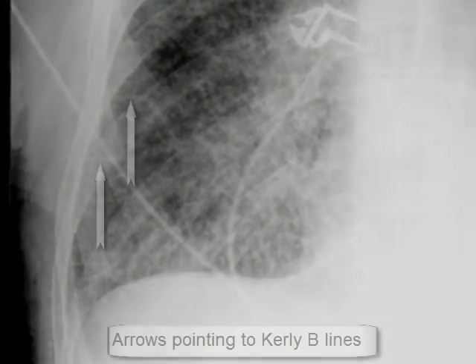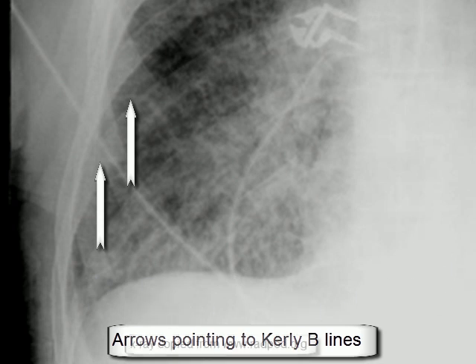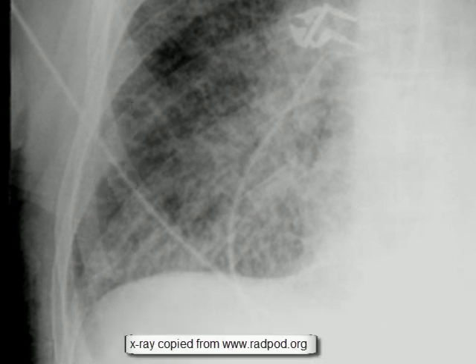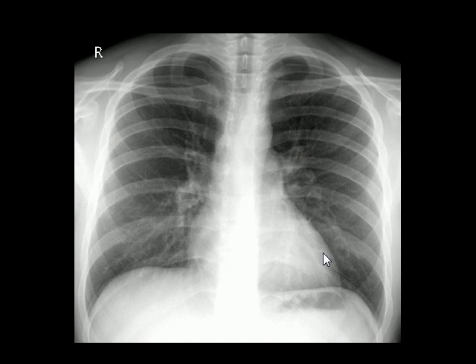This chest X-ray shows diffuse consolidation and Kerley B lines near the right costophrenic angle, and pleural effusion at the left costophrenic angle. Another chest X-ray is shown to demonstrate a healthy normal lung with normal costophrenic angles and normal cardiac size.